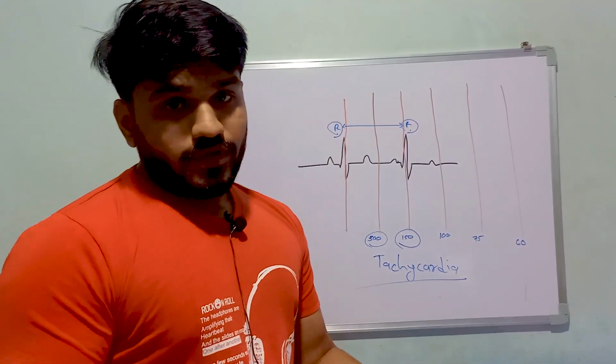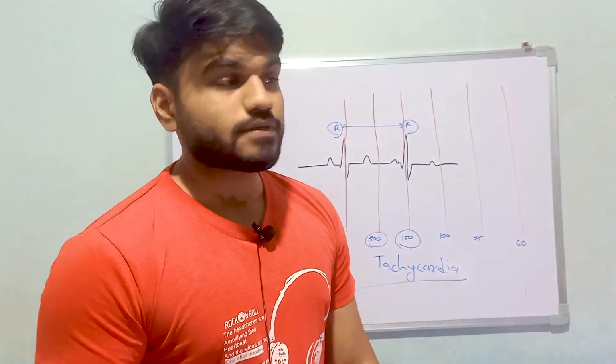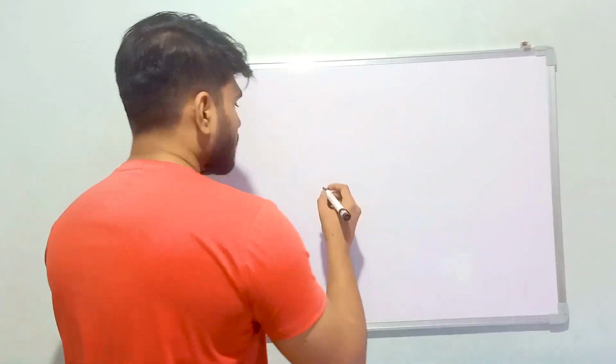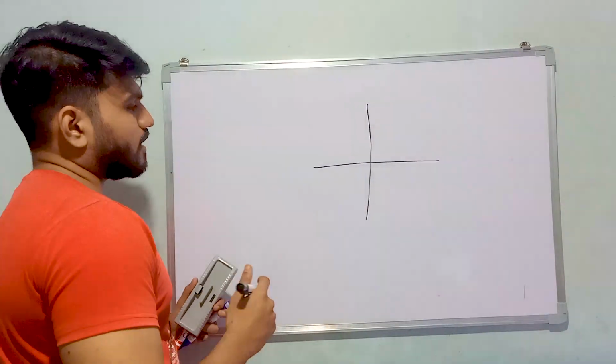So next we are going to move on to the axis. How will you know whether this is right axis deviation or left axis deviation? In order to understand the axis, you have to remember this graph in your mind. We are not going to draw it in your exam, you just have to remember it in your mind.